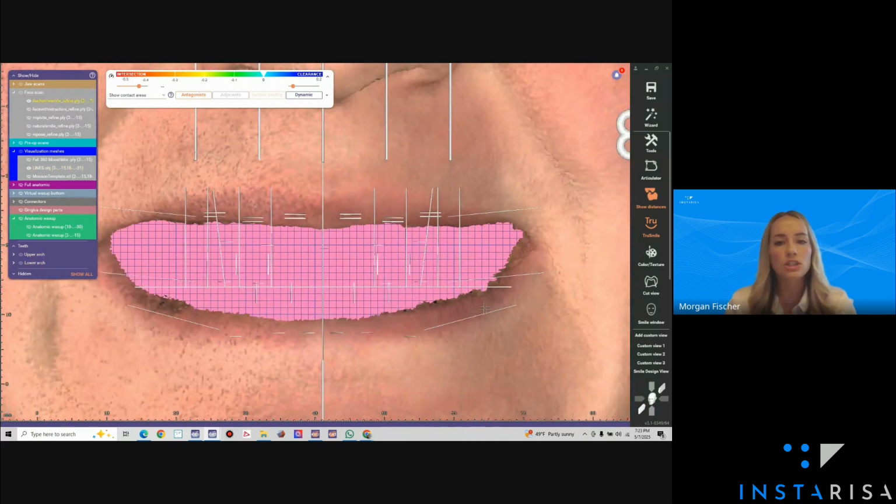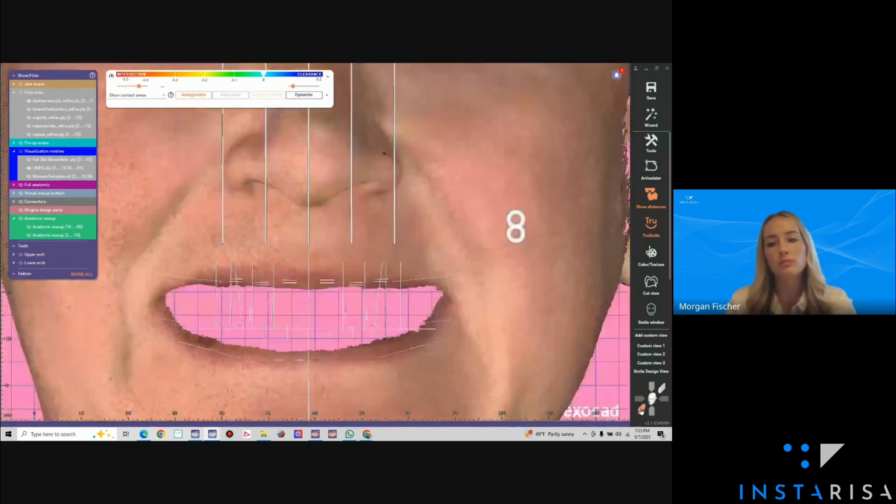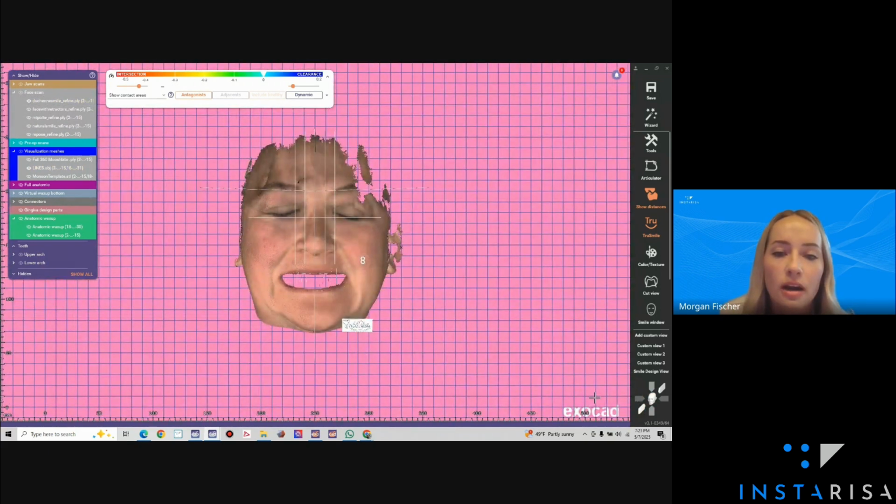Another thing I'm checking after I set my midline position and my incisal edge position is just bone reduction. So I'm turning on my Duchenne smile here. This is the most exaggerated smile. This is where we really want to see the patient's lip mobility to make sure that we're communicating with the surgeon so that on the day of surgery, we're doing enough bone reduction so that we are hiding that transition line.